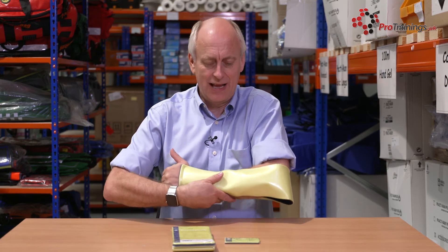Once it's bandaged in place, put that into a horizontal sling and keep it immobilised while getting them to hospital.